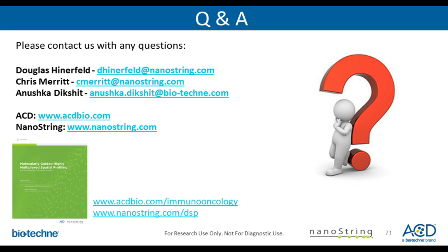Thank you. How is SNR from the GeoMx different than the normalized counts generated from typical nCounter output? Yeah, I can take that question. So the SNR is different from the typical nCounter output. Just based on time constraints, we didn't go through all the details of the RNA assay. But within the 84-plex gene IO panel, we actually put in 6 negative control probes along with the 84. Those are basically alien or scrambled sequences just to measure the background that we get for a typical probe. So we use those just for in situ.